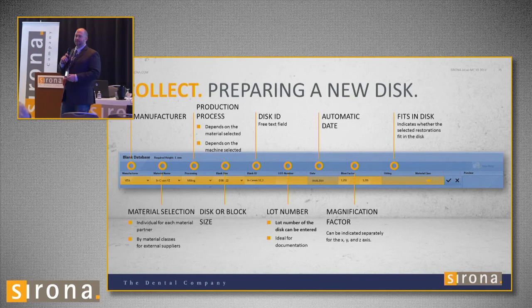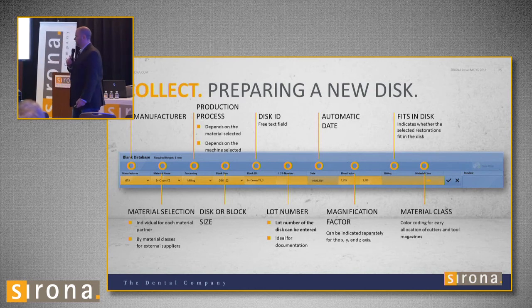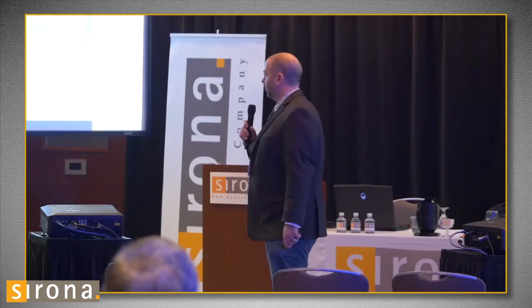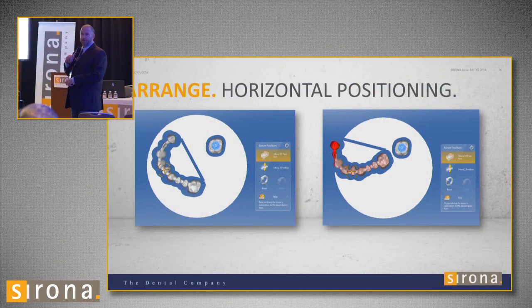The software will also indicate whether the restoration fits in the disc. If it doesn't fit, it'll say no — then you need a bigger disc. In the material class section, there will be a yellow, red, blue, or white indicator so you know which burrs to load. Once you choose your disc, you position your crowns in the puck. The software throws them in where it thinks is most optimized, but you have the ability to move them 360 degrees anywhere in the block you want. For large bridges, there's a centering bar placed automatically — right-click to remove it if you don't want it, but I recommend keeping it if the software thinks you need it.